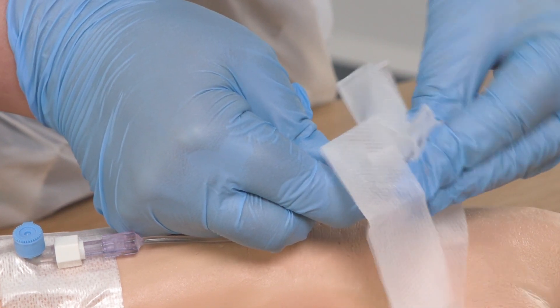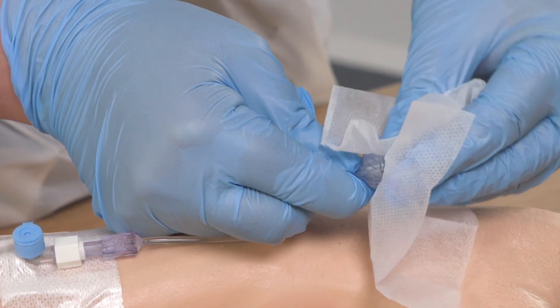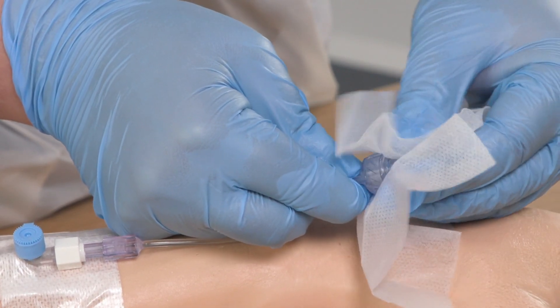I am now going to remove my PPE and perform hand hygiene again before taking my prepared equipment to the patient. I have performed hand hygiene again and put on new PPE. I am now ready to decontaminate the needle-free access device using a new 2% chlorhexidine and 70% isopropyl alcohol wipe. This is commonly referred to as scrubbing the hub. I am holding the device securely and I am going to clean the needle-free access device for a minimum of 30 seconds.